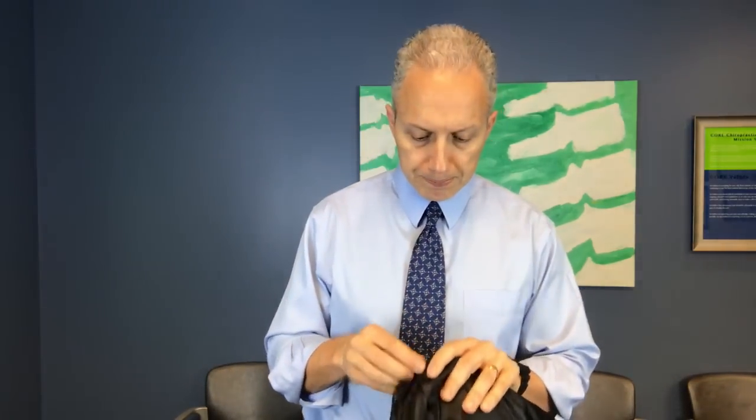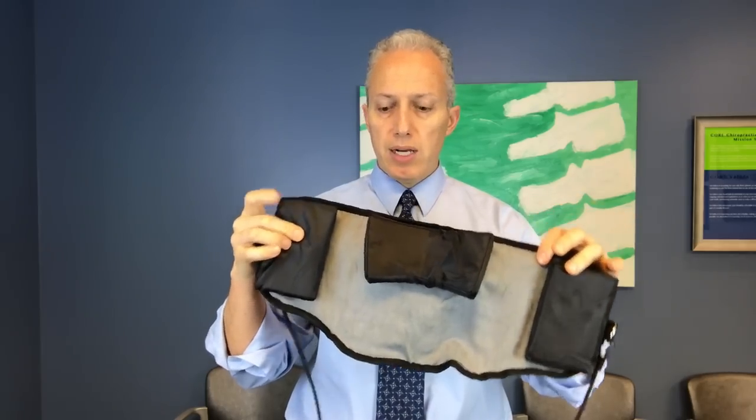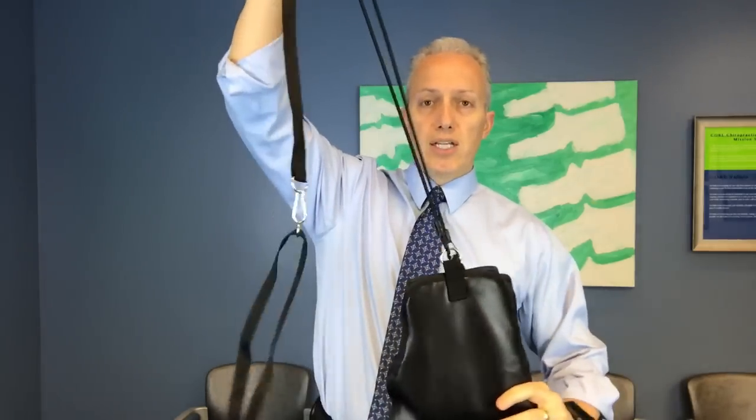There are no instructions on how to use this device. The back page just describes again how cervical traction would work. They're encouraging you to use it daily for about 10 minutes. When you open up the bag, you get this device — it's got some pads here for resting your head, pads here to make it comfortable on the sides, and then there's a strap that connects so that you can attach it to a door frame.